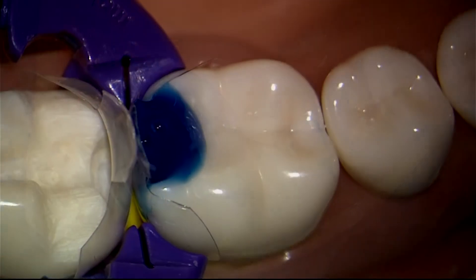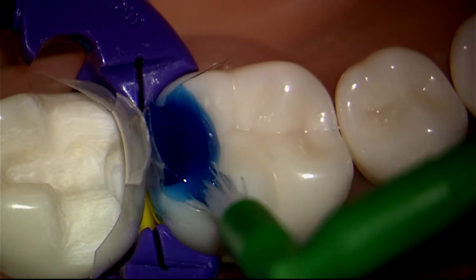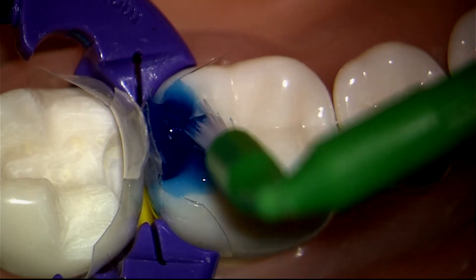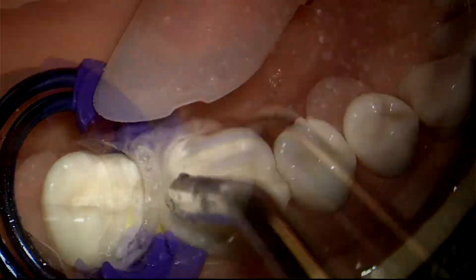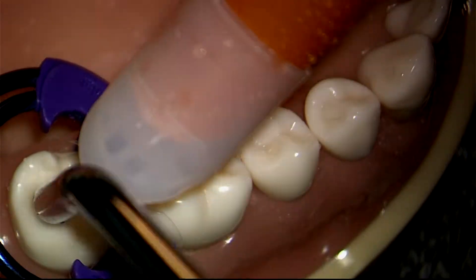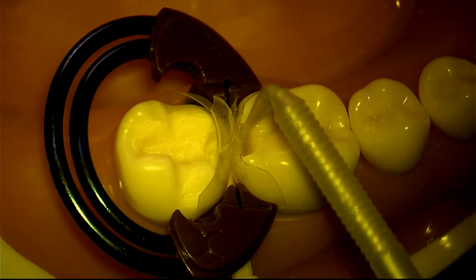Let me have a brush please. I'm going to agitate this just to make sure we've got our infinity edge well etched. We're going to massage the Scotch Bond Universal adhesive into the dentin tubules for a full 20 seconds.